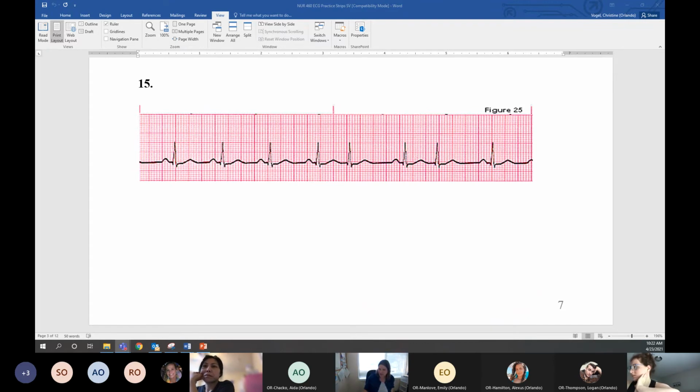All right, and then it looks like we have a PQRST. I'm happy. PQRST. Ooh, we're looking good. PQRST, still good. And then something's going on here. We've got an early beat, and I'm not seeing a P wave. And then moving on, I see a sinus beat here, PQRST. Oh, I see an early, no P wave. T, PQRST. What do you think we have here?